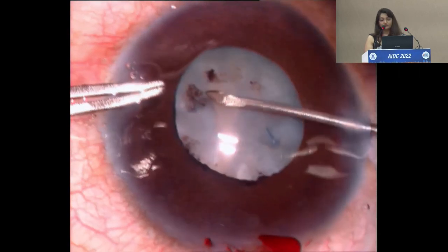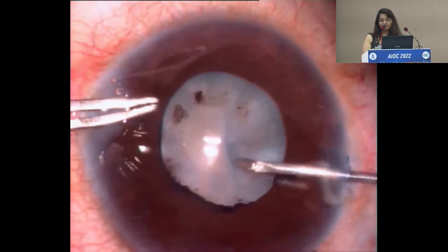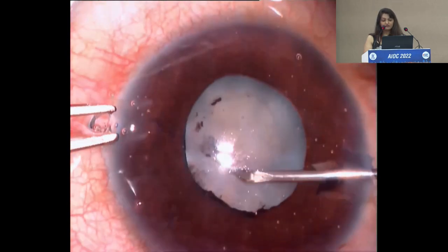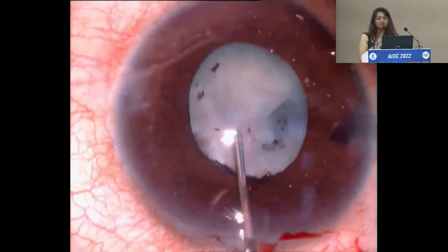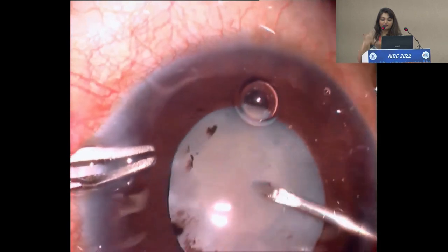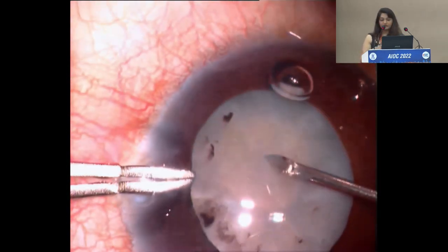I was trying from whatever flaps I was getting. At some point, I got a decent flap, and with a lot of resistance I continued my rexis, but there was still a lot of resistance, and I finished a very small opening in the anterior capsule. That is what I thought. But to my surprise, when I proceeded with the hydrodissection, my cannula was not going ahead, and I realized that I had removed just one layer of the anterior capsule, and the capsule was actually sitting there. So again I tried to poke it, and my bag was just moving and nothing else was happening.